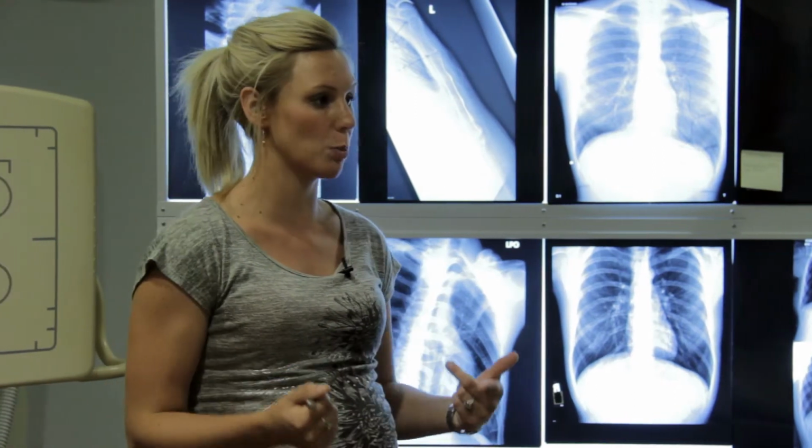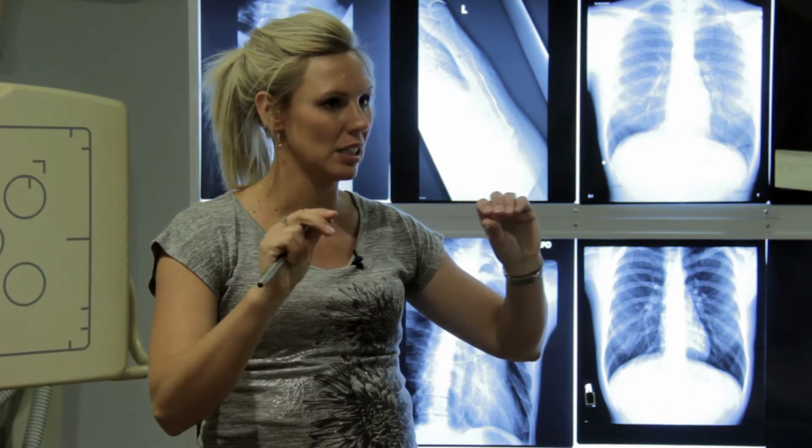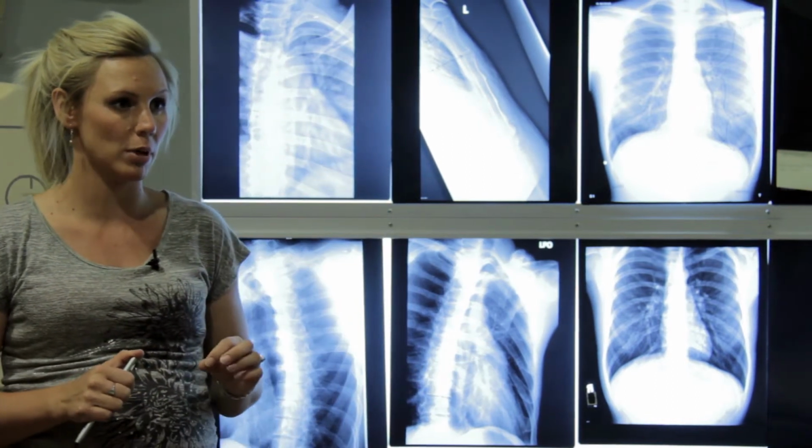Bras, elastics on bras, so even if somebody says, oh no, I have a sports bra on, still take those off. I mean, just take everything off. That thick elastic, even tank tops that have the built-in bra or whatever, take it off. These pictures end up with so much detail that those show up.